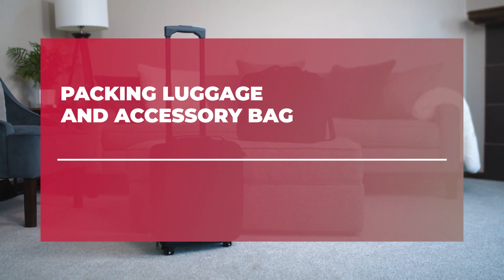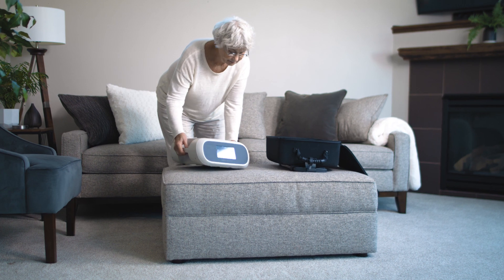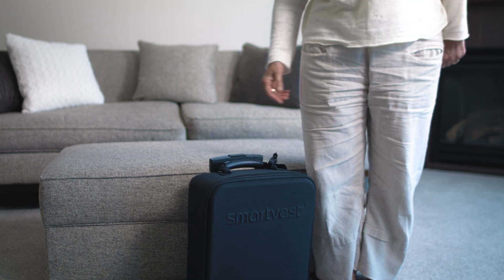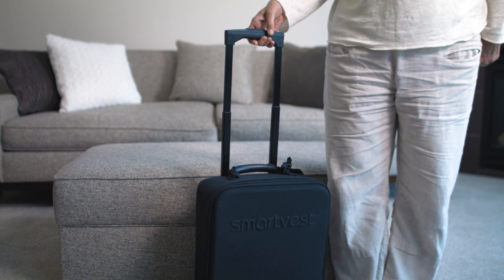The SmartVest Clearway system was designed for easy transport and storage with a compact wheeled carrier and accessory bag. The generator fits securely in the wheeled carrier and is equipped with a telescoping handle which adjusts to height needs. The wheeled carrier can be handled as carry-on baggage while traveling.